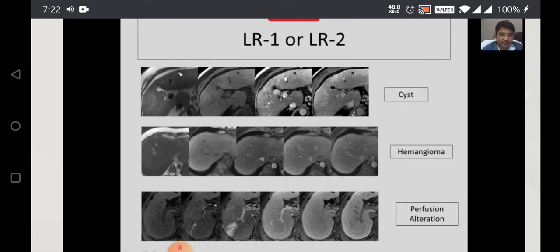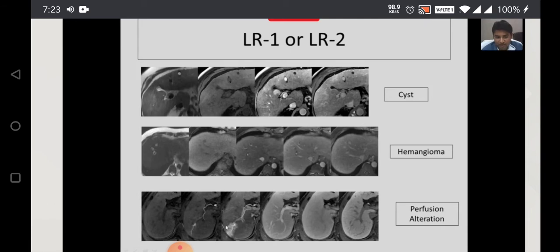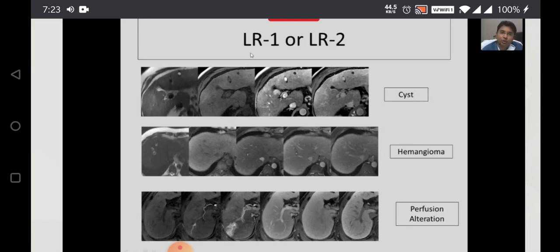If you see, this is a simple cyst — T2 hyperintense, no enhancement. This is a hemangioma which is bright on T2, showing peripheral nodular enhancement and gradual filling. And this is a perfusion alteration — a wedge-shaped area of focal hyperenhancement with undistorted vessels. So this is a perfusion alteration. This type of lesion is only identified when you gain some expertise. These are benign lesions which have to be categorized either as LR1 or LR2.